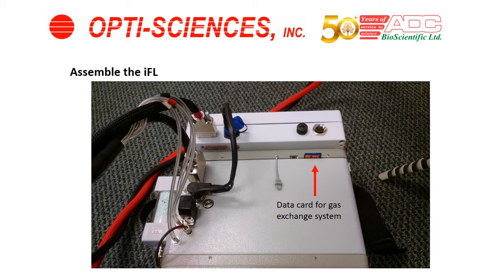Take the second data card and put it into the LC-PRO SD as shown. The system takes one or two gigabyte data cards — memory cards. Those are the only kind that will work with the system.